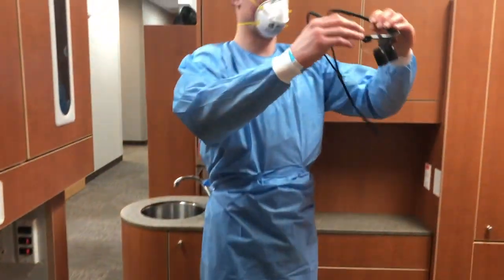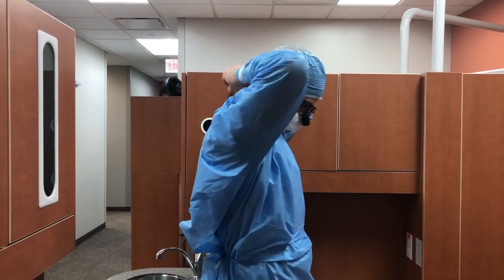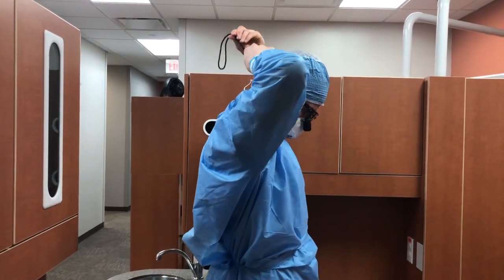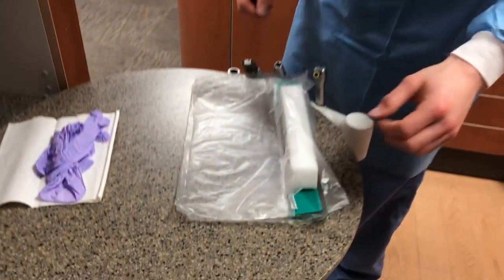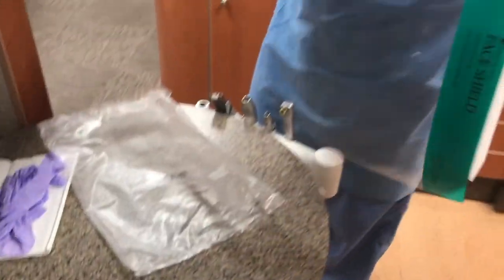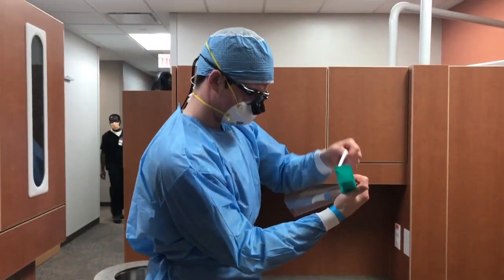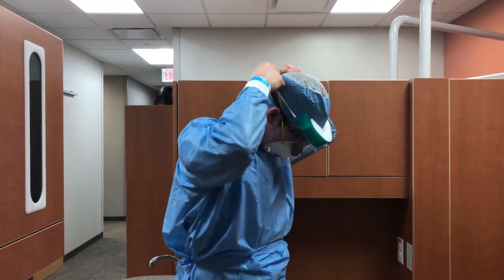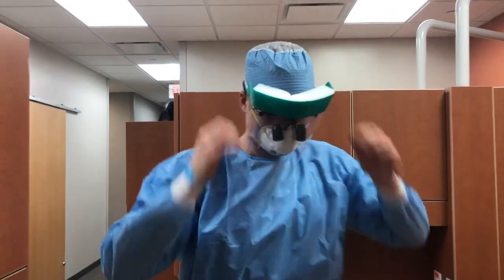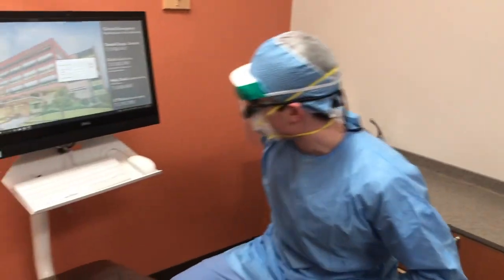Next, you can put on your surgical loops or other protective eyewear. Make sure that you adjust these so that you don't need to adjust them again. Now place the face shield and make sure it too is adjusted comfortably. You can now enter the treatment area.